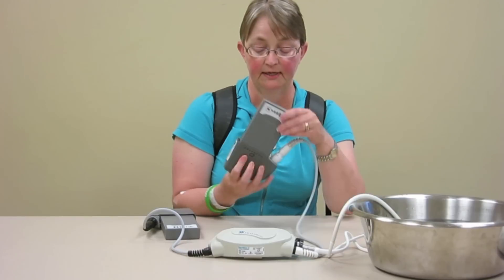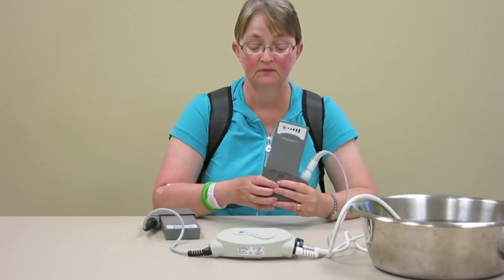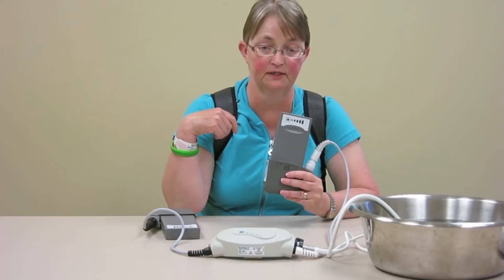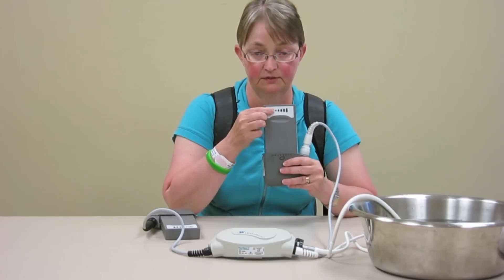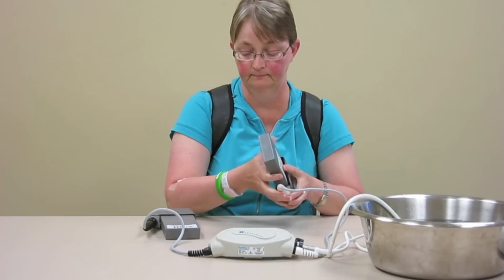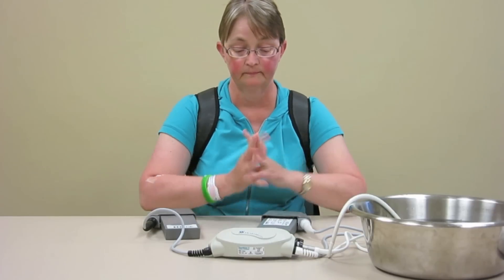You can also check the battery status right on your battery. It does everything in five lights — these are in 25% increments, whereas this one is in 20% increments. That's your components.